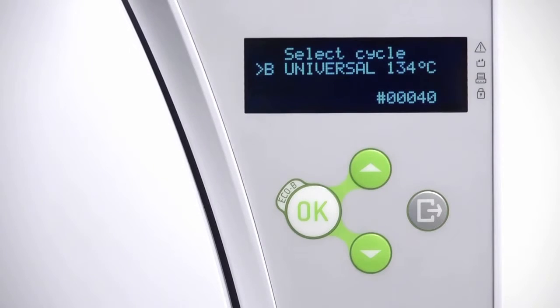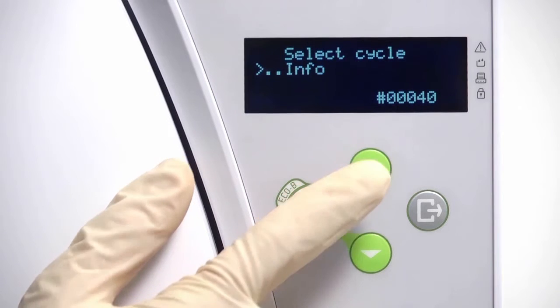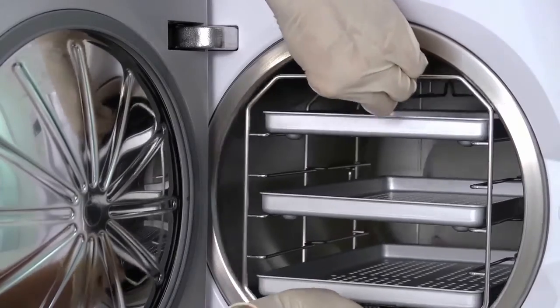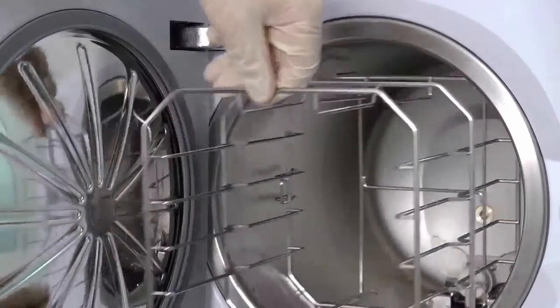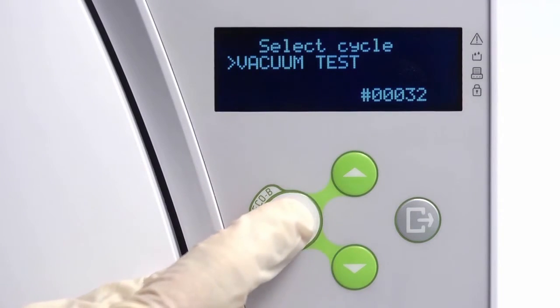Prior to the test, it is imperative to ensure that the temperature of the internal chamber is cold, or no greater than ambient room temperature. This can be checked by viewing the T-H-E value on the menu screen. You should also confirm that all trays have been removed from the chamber, and any signs of condensation and or water have been removed. Close the door and select the vacuum test cycle from the test cycle submenu.